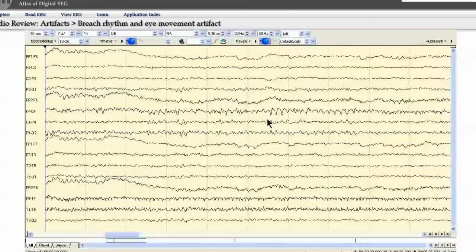The EEG becomes abnormal, however, if there is slow activity. By slow activity, we mean theta and delta activity, which intrudes on the background and disturbs the baseline. Here we can see, as I show you with the black arrow, the baseline remains flat, superimposed upon which we see beta frequencies and some alpha frequencies.